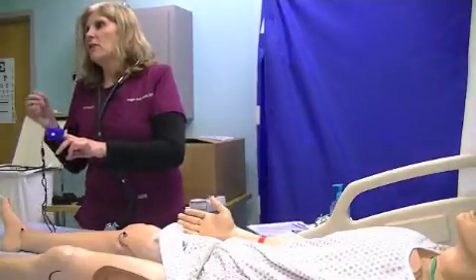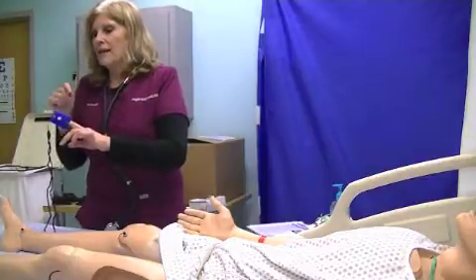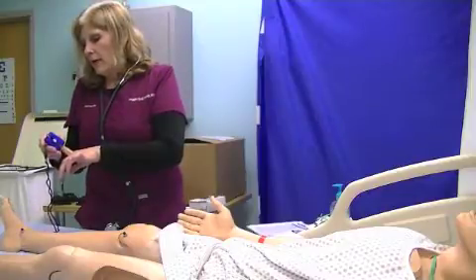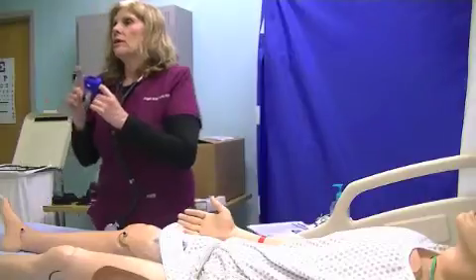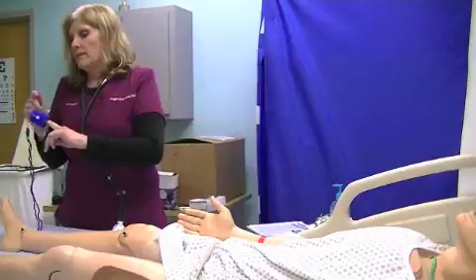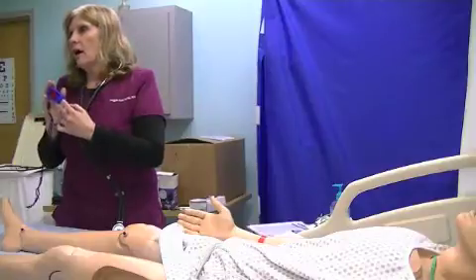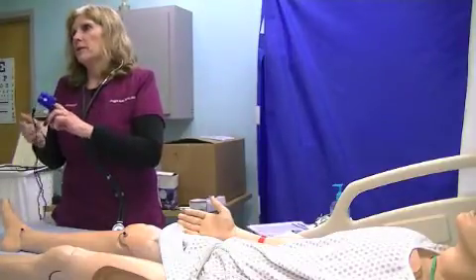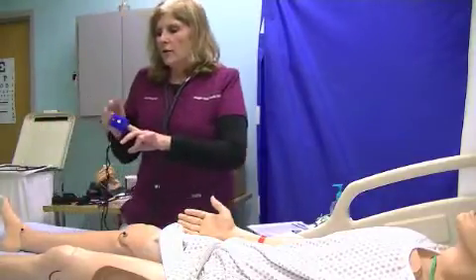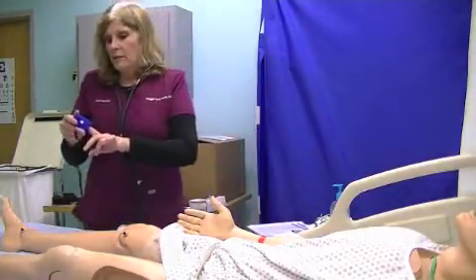So it reads the saturation of oxygen. Hemoglobin is what carries oxygen in blood. It reads from hemoglobin, infrared, reads that hemoglobin saturation of oxygen in the blood. So this says my heart rate is 109 and O2 saturation is 97. One thing I'm going to tell you about these, don't believe the pulse rate they show here, because I know my heart is not jumping out of my chest right now, and it's not 109 or whatever like that.